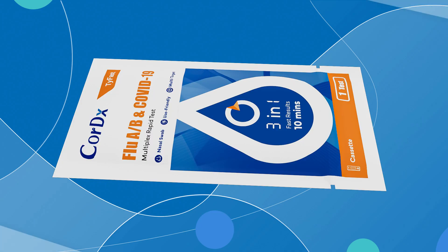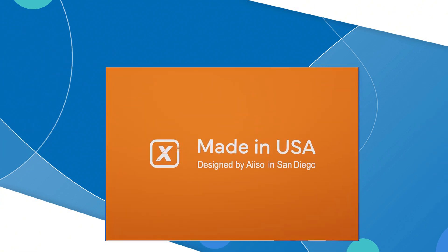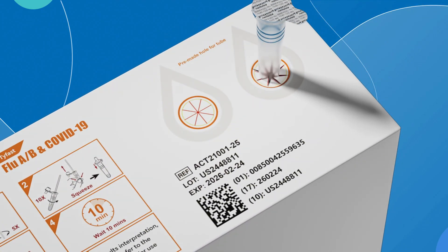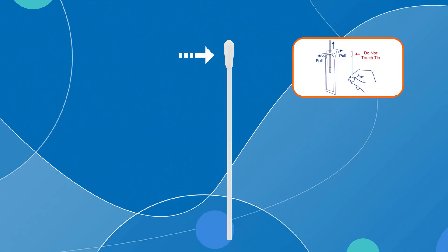Let's move on to the testing procedure. First, open the test cassette packaging and place it on the table. Then open the tube and insert it into the pre-made hole for the tube on the back of the box. Remove the swab from its packaging to collect the sample. Be careful not to touch the soft tip of the swab with your hands.